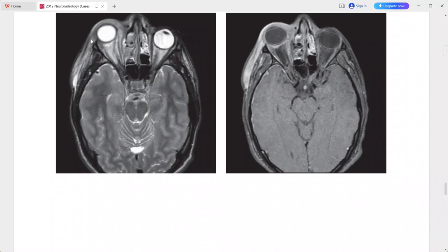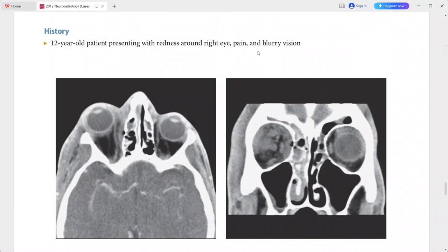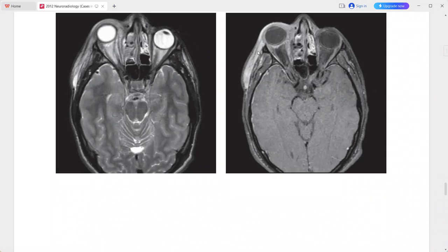There is periorbital and right facial swelling, and enhancement is noted in the post-contrast sequence. This is a case of subperiosteal orbital abscess. Differentials include orbital hematoma, other orbital abscesses, and congenital lesions such as dermoid cyst or lymphatic malformation.